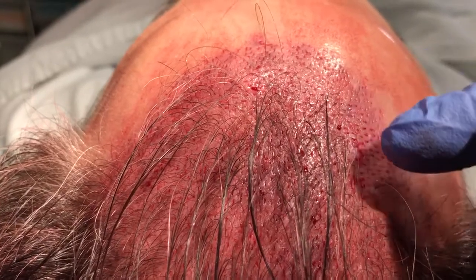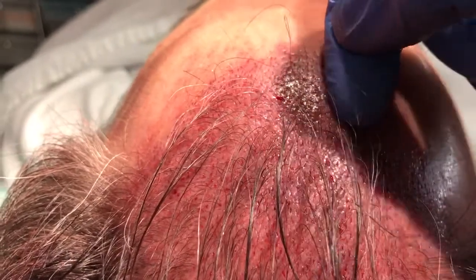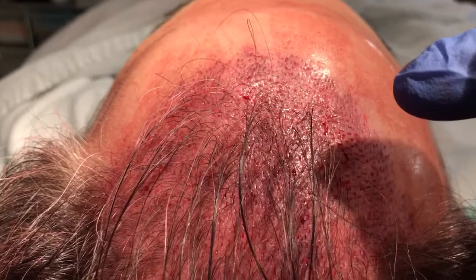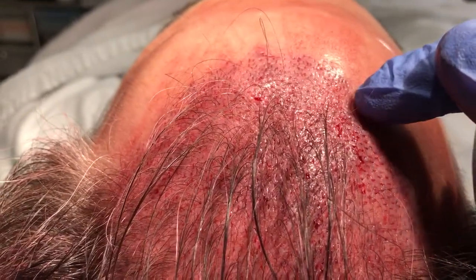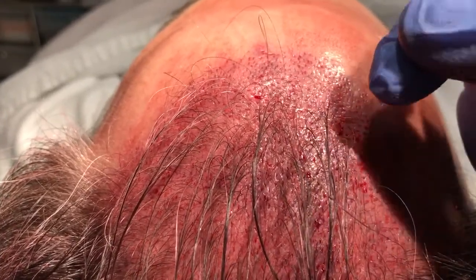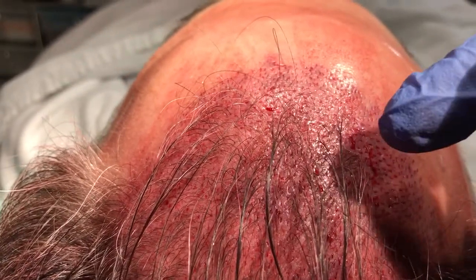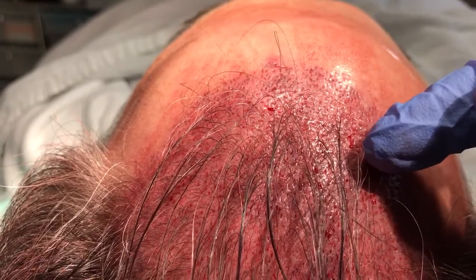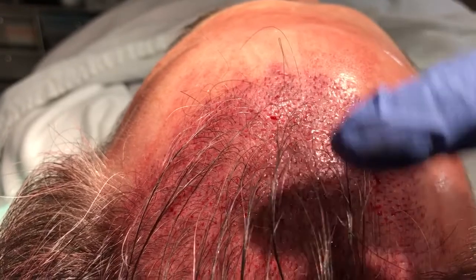A few technical points that I want to mention about going from sagittal to coronal. Number one is the angle. The angle refers to the position like this of the site. It is very easy for a novice, and I notice this all the time when I train surgeons at my hair course, that when they transition from a sagittal to a coronal site, the angles change because their hand angle is not holding the needle the same way. So it's very important that the transition from a sagittal to a coronal, or perpendicular, site will have the same angulation so that everything will look natural.